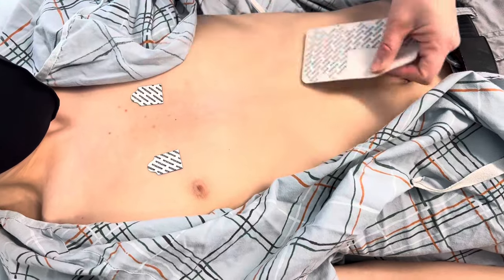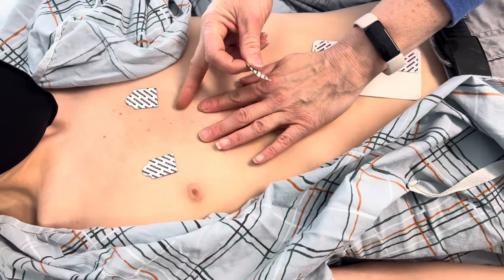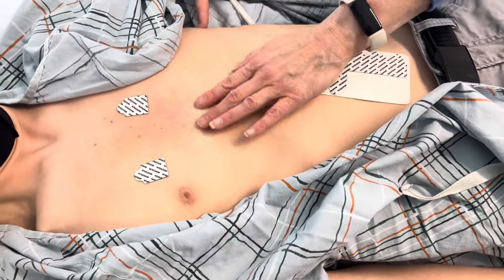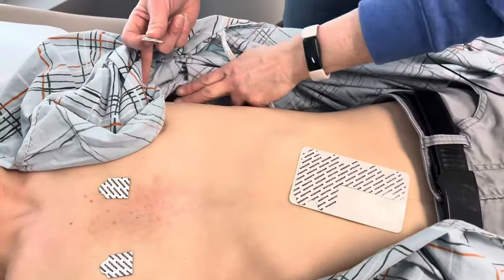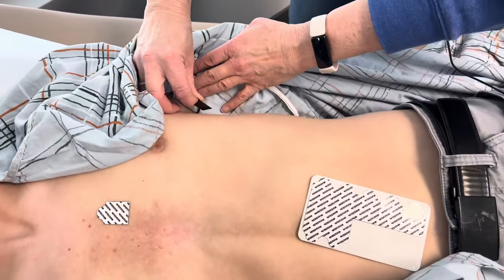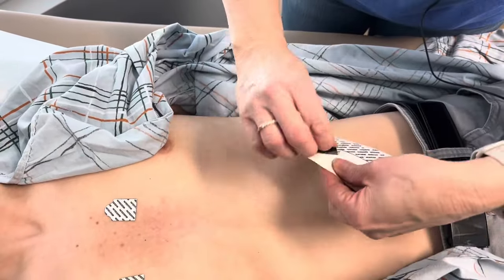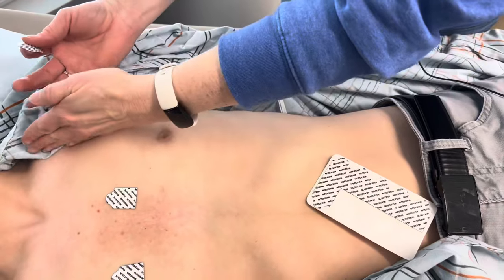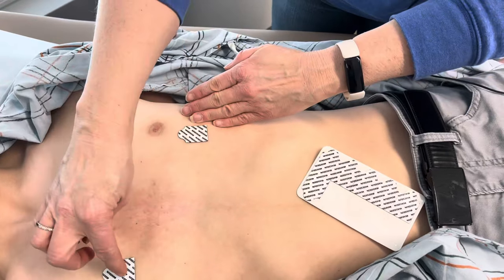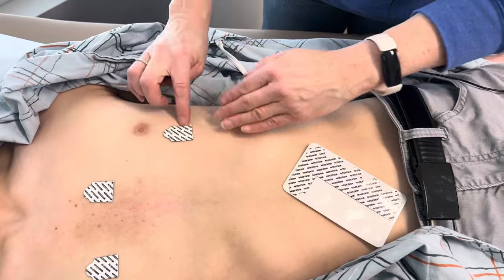Then I go over and do V6. This is going to swoop around the heart, and V6 should be along the axillary line — the middle of the side. One lead will be mid-clavicle, straight down. So: one, two, three, four, five, six.